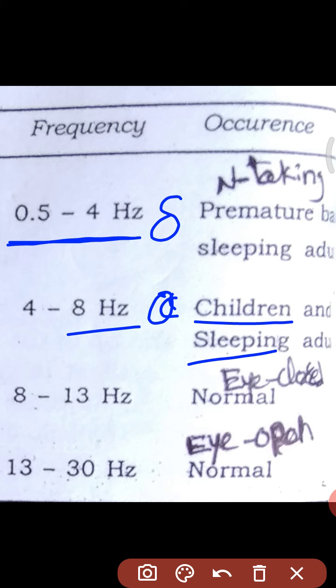The third one is the alpha wave, which is 8 to 13 hertz. When the eye is normally closed, you are generating the alpha wave frequency. And the last one is the beta wave frequency, 13 to 30 hertz. When the eye is open, we need to generate this beta wave frequency.